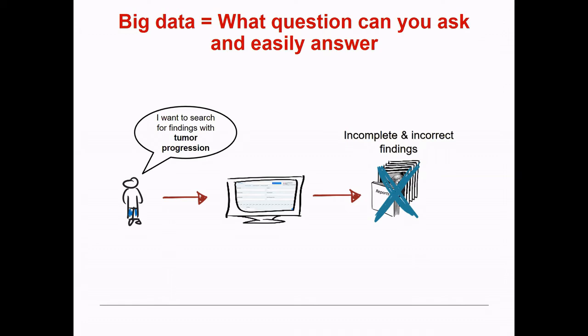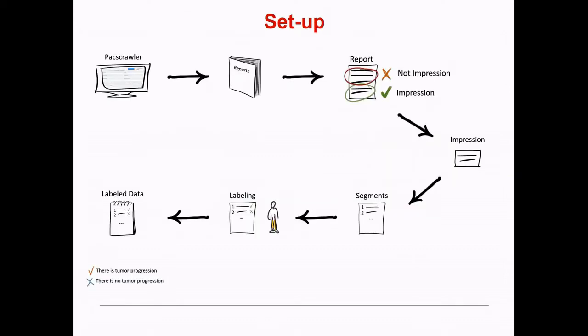So this is something that then moved us to kind of say, okay, report, what does it mean? So I already told you, although we call our report structured, I would still argue that they are unstructured. But in this radiological information system, if you have a deep connection to it, at least the report has two parts, right? The impression is like the comprised part, where you kind of say what do you think that it is. So if you have the description and the impression, that's what I wanted to say.